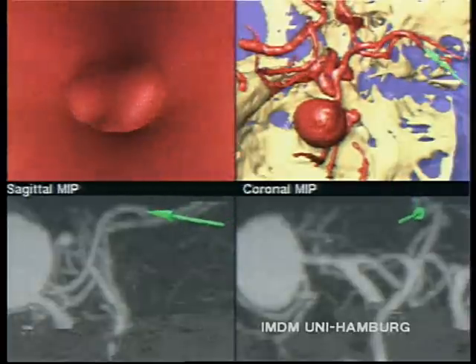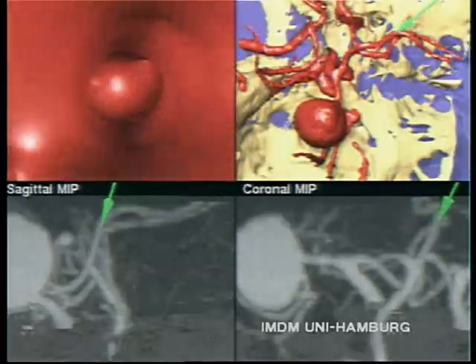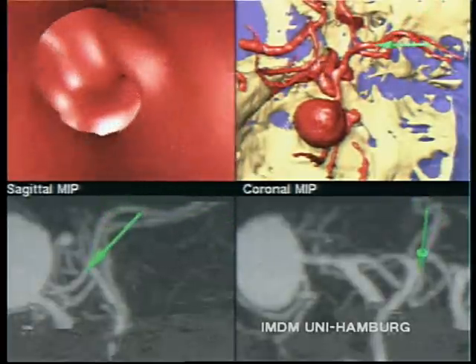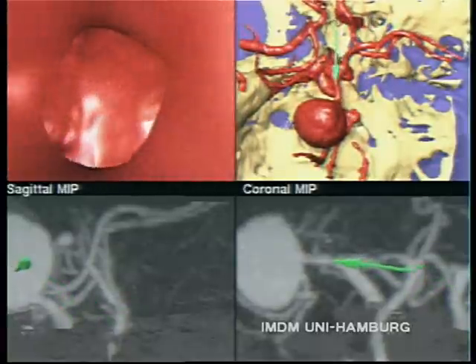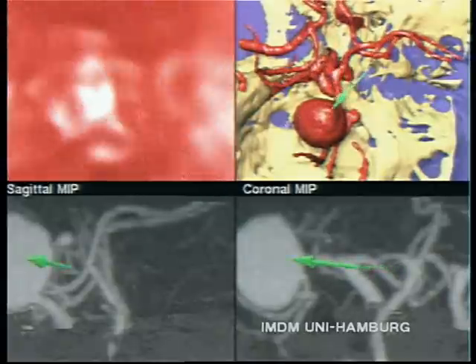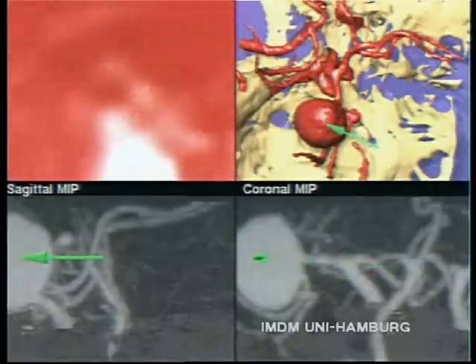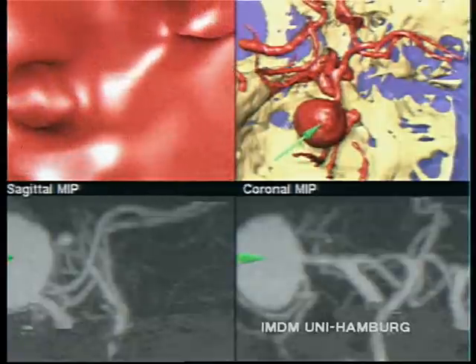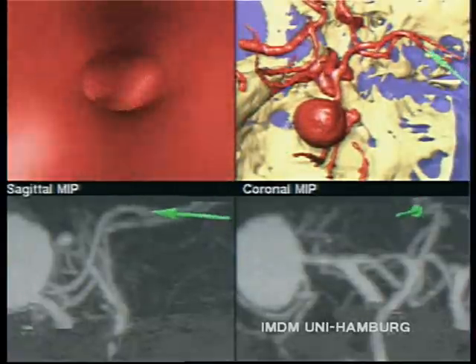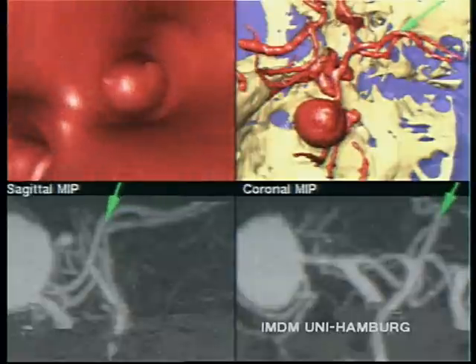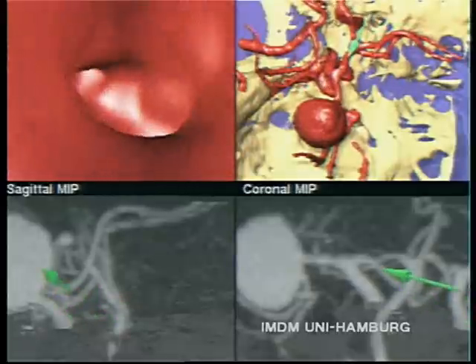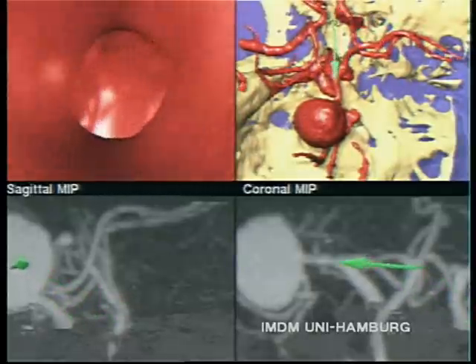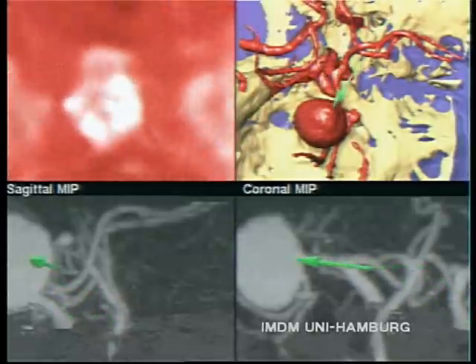We repeat the scene. We enter the anterior cerebral artery, proceed into the middle cerebral artery, follow the path to the aneurysm, turn around and look back to the orifice we came from. The scene once more — arrival at the aneurysm.